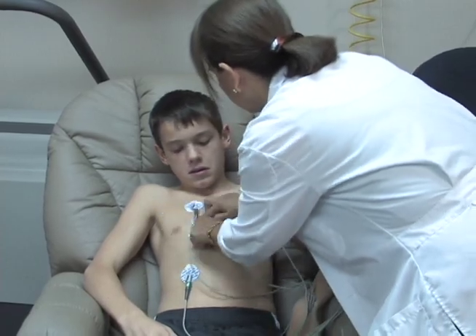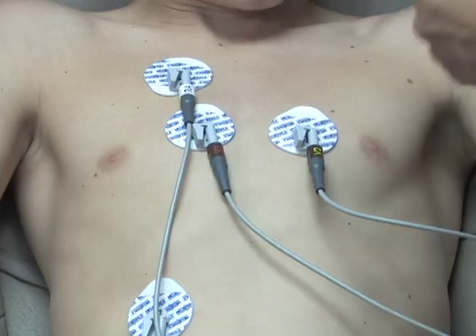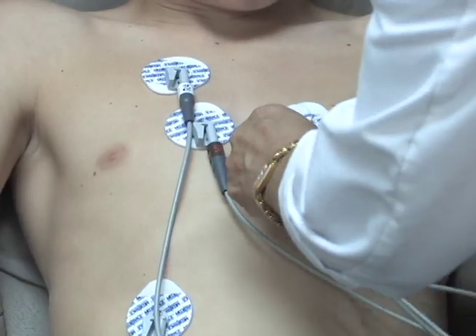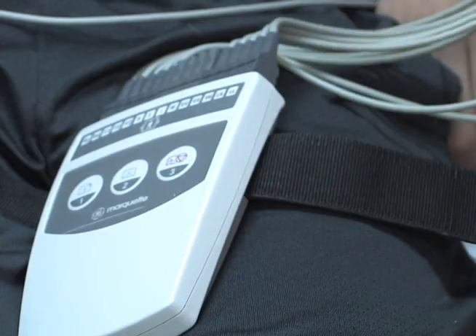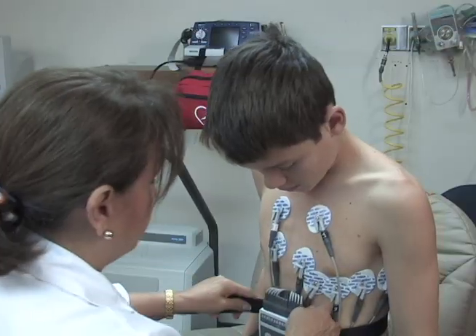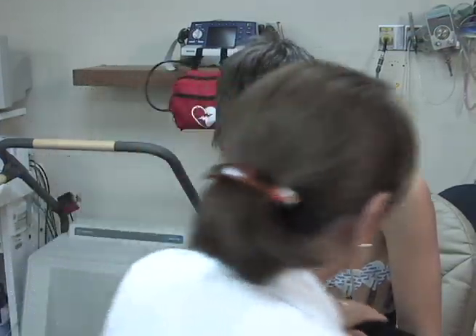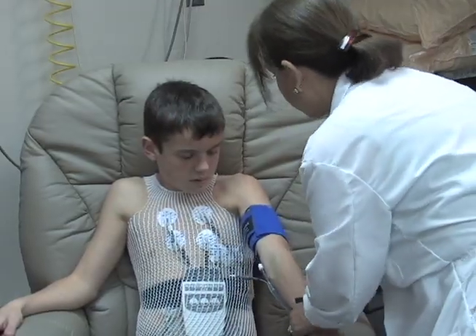First, the electrodes are placed on the patient's chest, and then those electrodes are connected to cables to allow the heart rhythm to be monitored. These electrodes and cables only monitor the heart rhythm — they do not cause any discomfort to the child. The cables are typically secured with a band to hold them in place, and then a mesh vest to allow the patient to run on the treadmill.